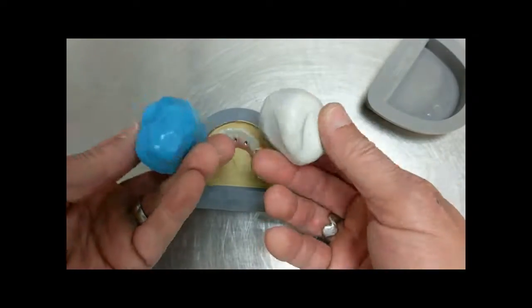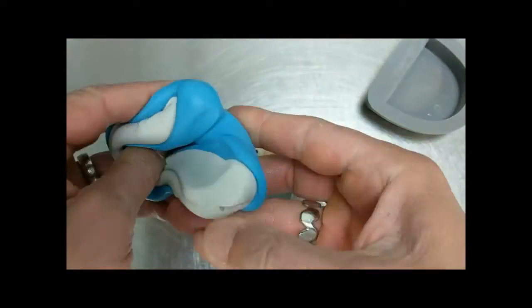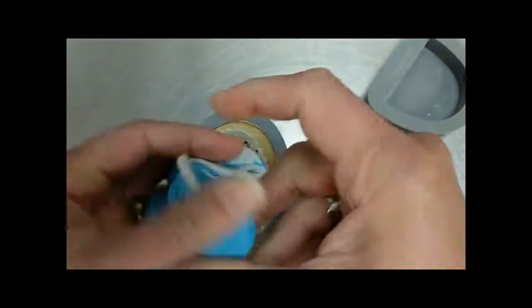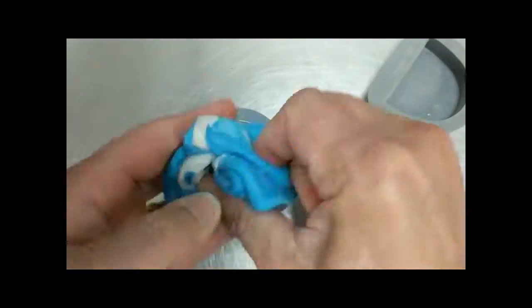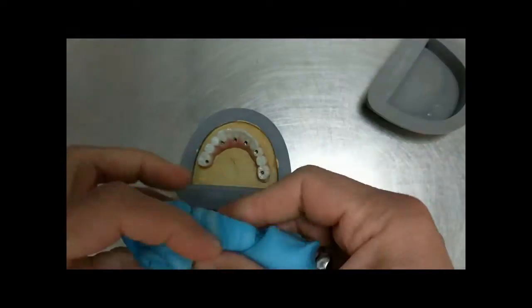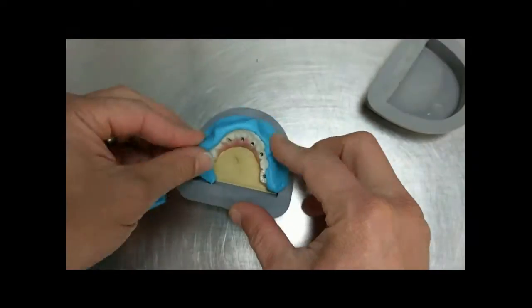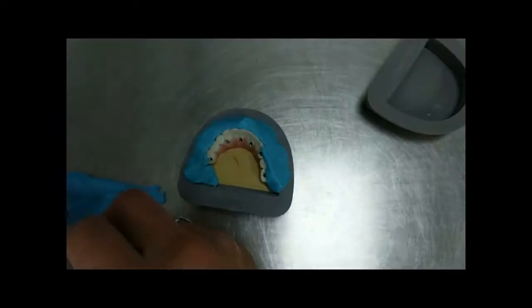Once the stone is set, use a lab putty in order to encapsulate the prosthetic. You'll notice in this video that we did use the top and bottom of the flask, although it's not necessary. As long as the flask is completely encapsulating the prosthetic, then the task can still be completed.